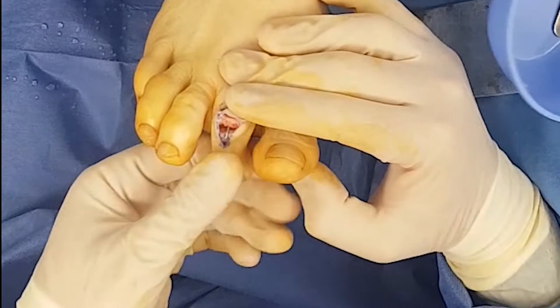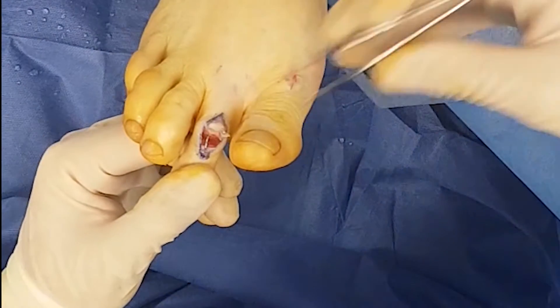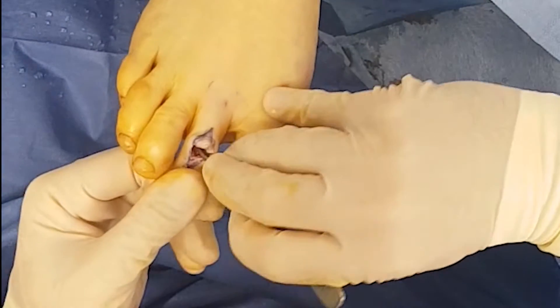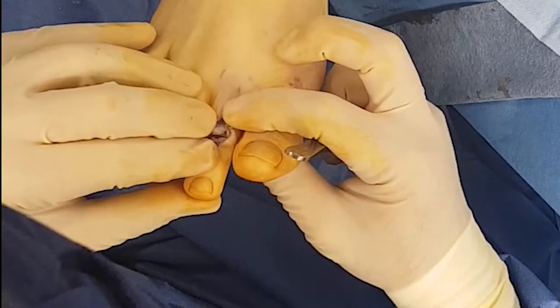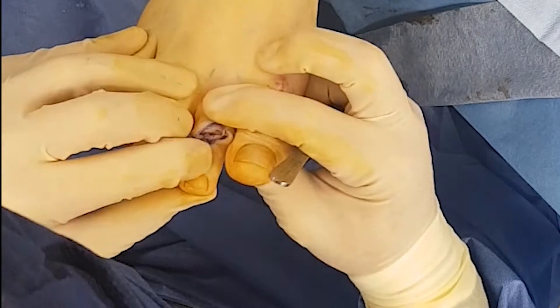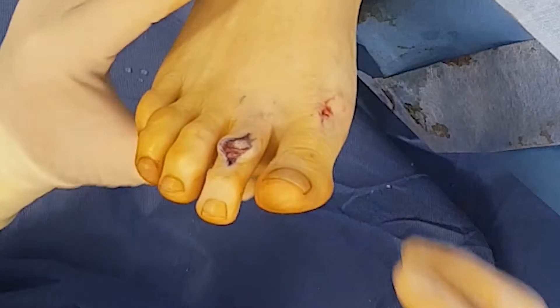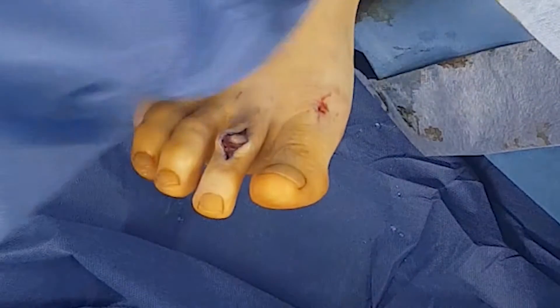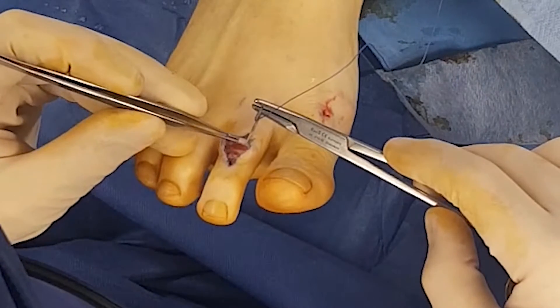So the wire was bent, inserted into the proximal phalanx, and now it will be put into the base of the intermediate phalanx and pretty much clicked into place. Once the wire is positioned adequately and the two bony surfaces are closed up nicely, we will start to suture up the extensor tendon again.